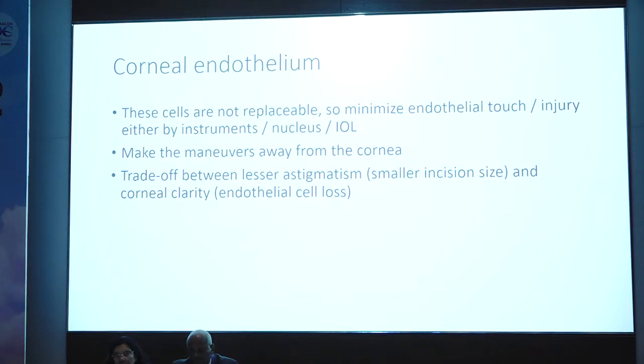In fact, again, meta-analyses have shown that a small amount of astigmatism in SICS gives near vision, because it's like the Sturm's conoid. The smart SICS techniques work on that, because the horizontal and the vertical corneal curvatures are slightly different. So that increases the depth of focus. So the EDOF lenses that we put, and we pay a lot of money to put in those lenses, something like that automatically happens in SICS.